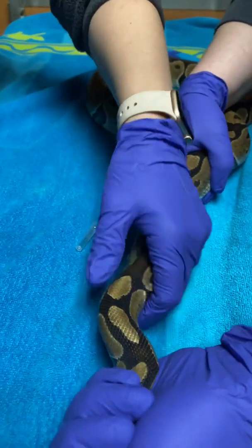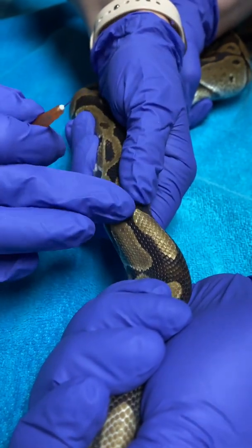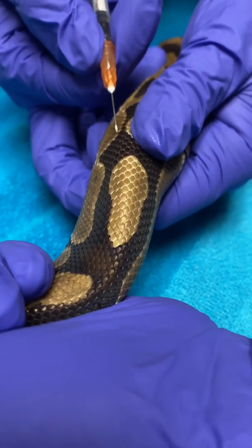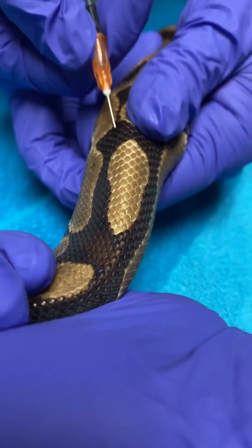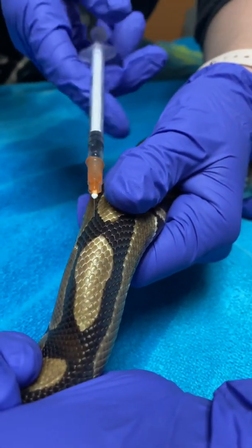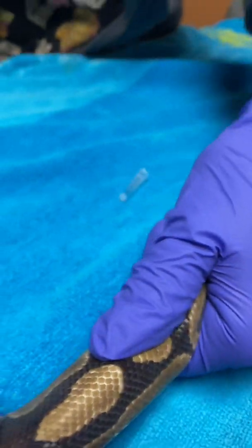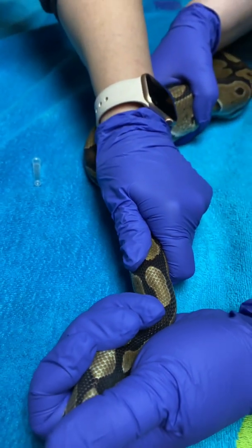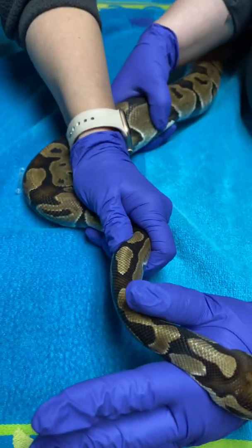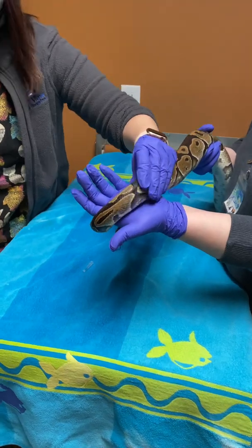Take your hand and feel for the spine right there in the middle — you can feel the bone right there. Go off to either side and in between the scales. You don't have to go very far. Pull back to make sure you didn't get any blood or air, and then just give the injection. When you're done, put your finger on it just to hold off. There might be a little bit of bleeding, but not very much because you didn't give it into a vessel. Make sure the bleeding has stopped.